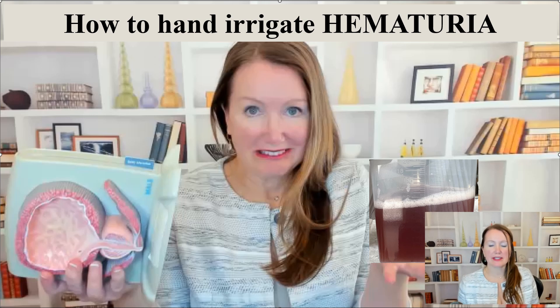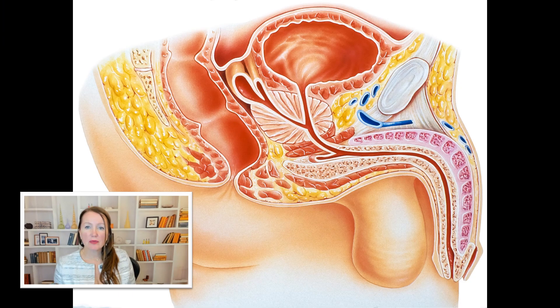Hematuria is the presence of blood in the urine. This video teaches how to irrigate hematuria, removing blood and clots from the bladder. When blood clots block the bladder, they can prevent it from emptying, and this can be extremely uncomfortable, even painful for the patient.